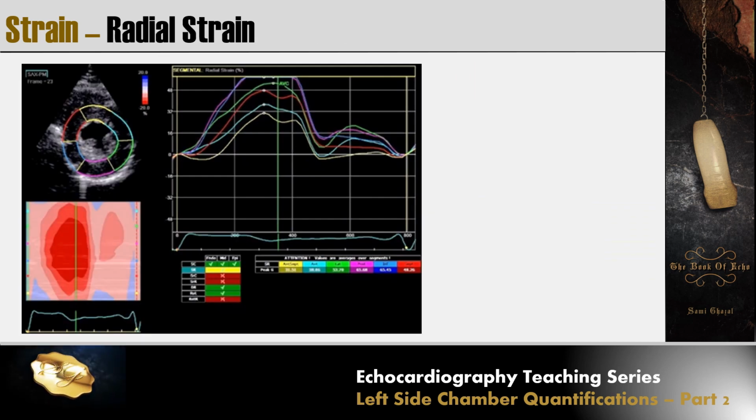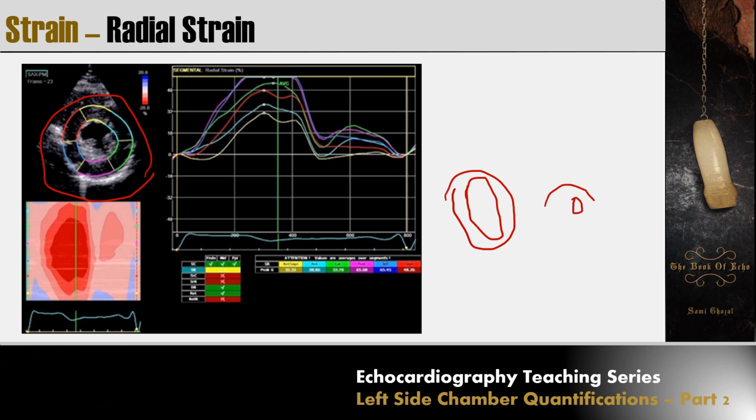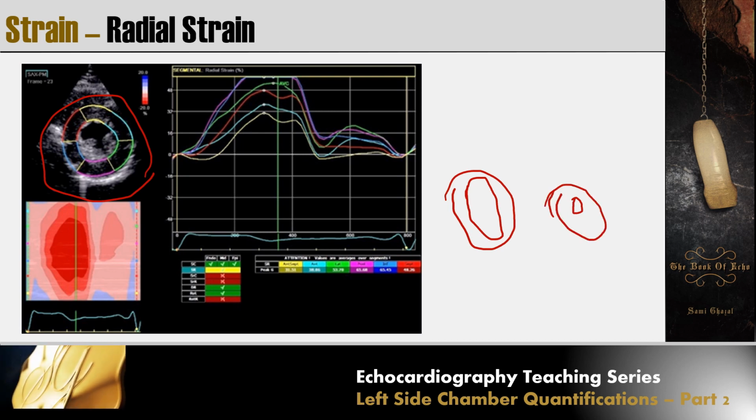Radial strain and circumferential strains are obtained from the short axis view here. Because it is thickening, if you look at this radial strain, let's say this is in diastole and this is in systole, this segment here is thickened during systole.